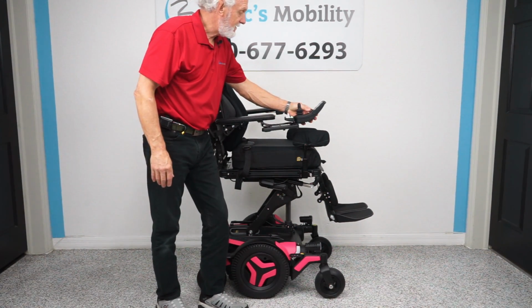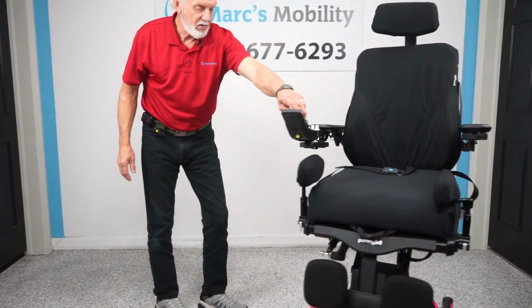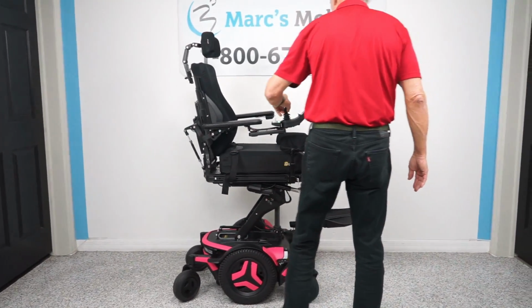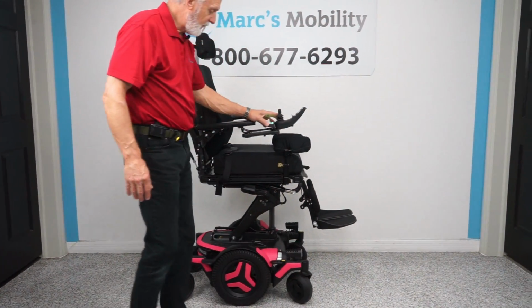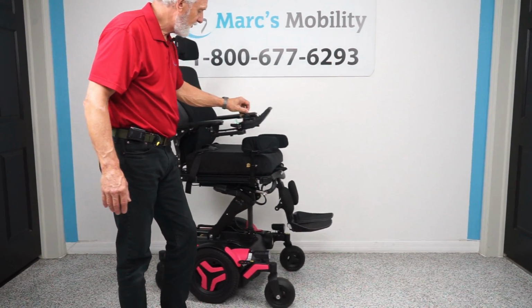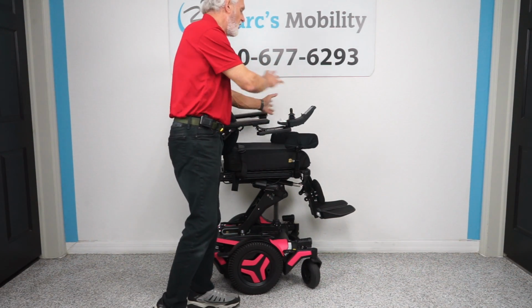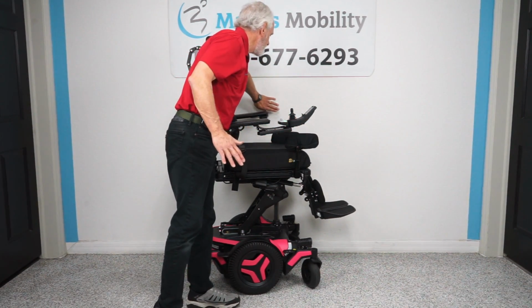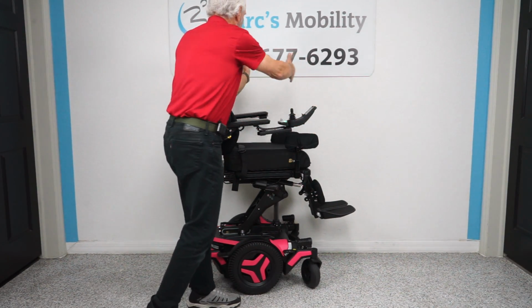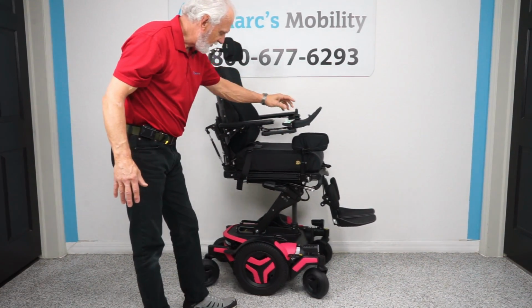The nice thing about this is, even though the seat's elevated, you can still drive the chair, as you can see, at a good speed with the seat elevated in your house. Okay? If you're going to use this chair in your house, when you go to a counter, you'll start this way. Your counter will be here, so you'll be working away from your joystick. You can get a lot closer to your counter and grab stuff off the cabinet. You don't want to be coming forward straight up because it's a lot better to go in sideways like this, okay? Let's look at the base on the chair.